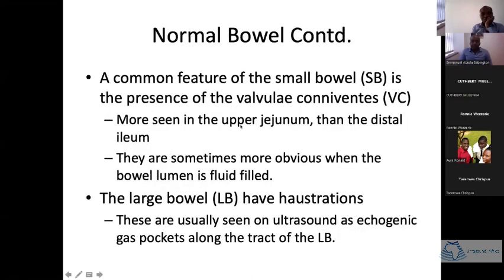Bowel thickness is a very important parameter in examining the bowel. A bowel with an abnormal thickness will most likely be abnormal. Once you see an abnormal thickness, you need to look around for other features that would support that diagnosis, like color Doppler, which you check for hypervascularity, and checking for free fluid, and stuff like that, working together.